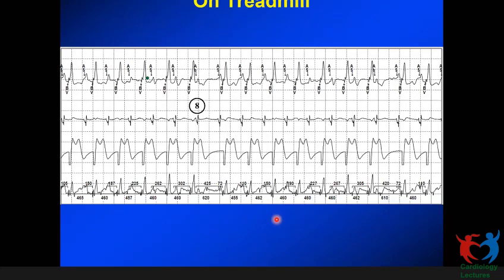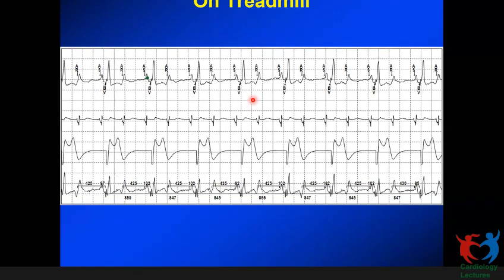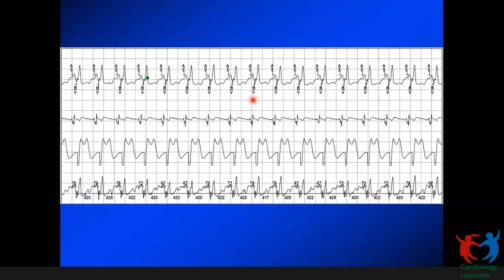So let me skip this calculation. So if you go back once again to the CRT patient who was on the treadmill, which resulted in Wenckebach and then also in a 2:1 block, if you program the PVARP or the upper tracking rate appropriately, now you can allow a reasonably higher upper tracking rate, which you consider as physiologic for this patient, resulting in ventricular pacing, which will avoid symptoms for the patient. And that's how you may want to program. So to do that, you may want to consider programming a higher upper tracking rate and also reducing PVARP.